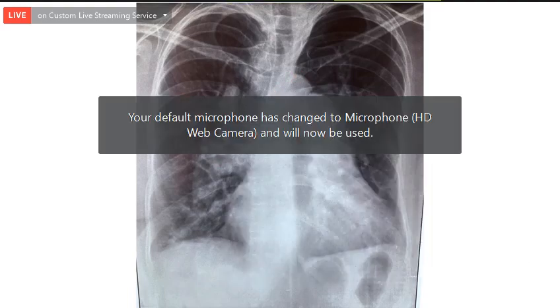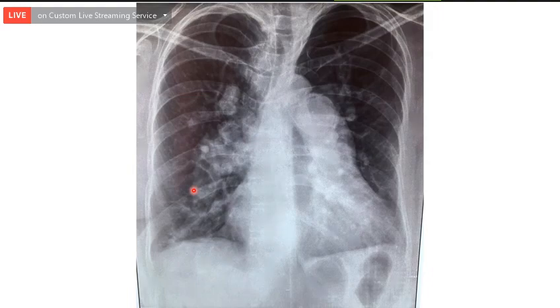Sir, right pulmonary artery is very prominent. And sir, it is dilated also. From the left side, sir, there is a main pulmonary artery dilatation. Left pulmonary artery we cannot see so well, but still. Sir, this is also left pulmonary artery only, sir. Because this being a slightly over-penetrated view, you can clearly see the left pulmonary artery. So, sir, MPA, RPA, LPA, all three are dilated.